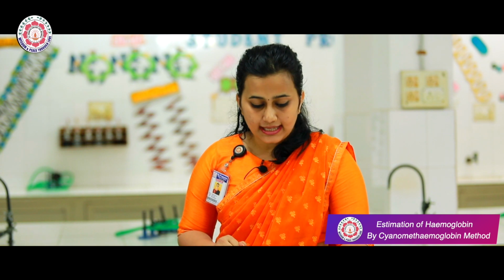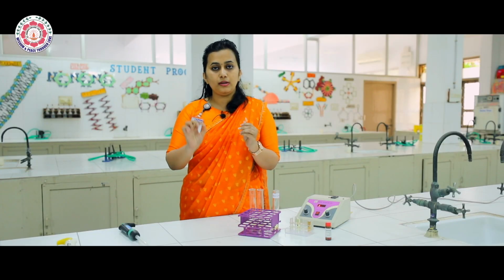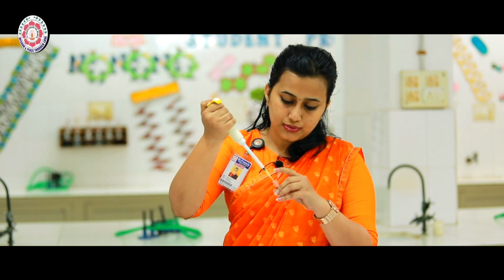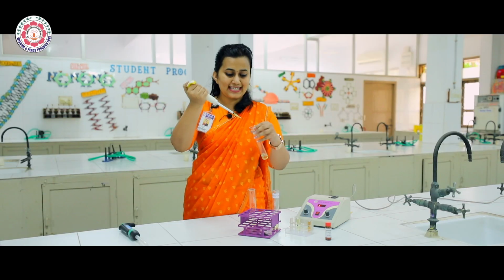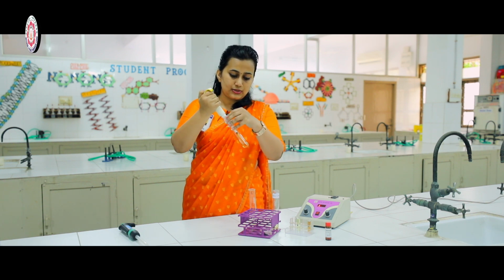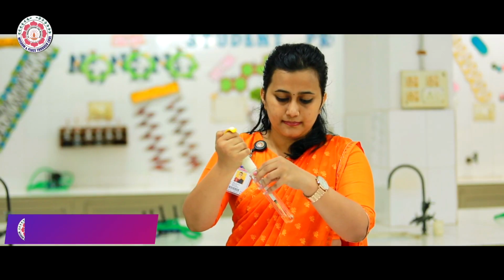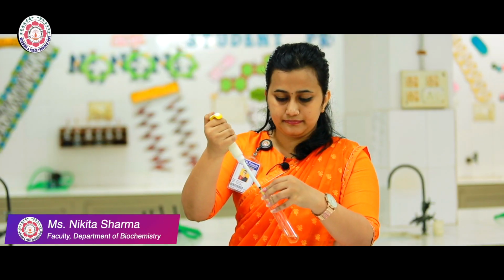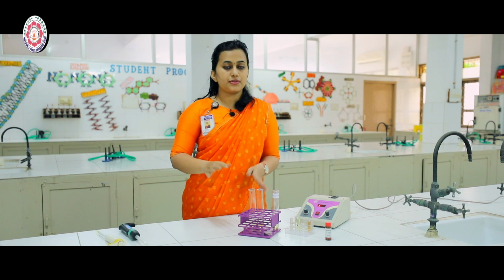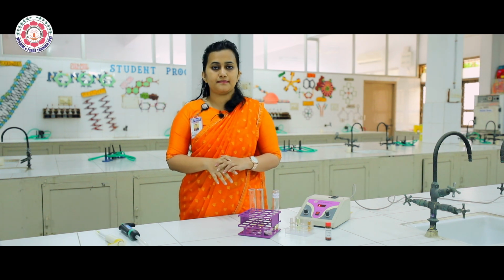For the next step, in the test sample we will be adding 0.02 ml of blood, and we will be using whole blood, which means it should not be allowed to clot. I will be using a micropipette to take out 0.02 ml of blood and add it into the test sample. Make sure all of the blood is dissolved into the Drabkin's reagent. This can be mixed well, and now we are going to keep this aside for 5 minutes of incubation.